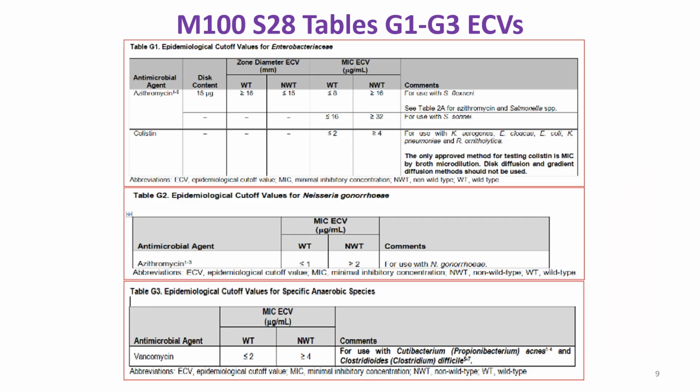For MICs, where the MIC is less than the epidemiological cutoff value, it is taken as a wild type. So take the example of azithromycin against Shigella flexneri: when the MIC is, say, 4 and the wild type ECOFF is 8, the MIC of 4 is taken as a wild type. That is, it has no resistance mechanism. If the MIC would have been 32, which is more than the ECOFF, then it will be termed as non-wild type, and it has some resistance mechanism. So it depends upon the epidemiological cutoff that you can interpret whether the bacterial population has a resistance mechanism or no resistance mechanism.